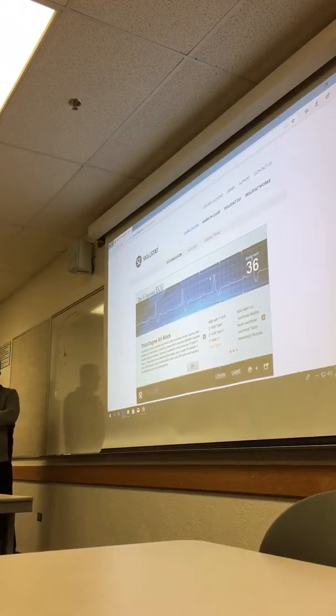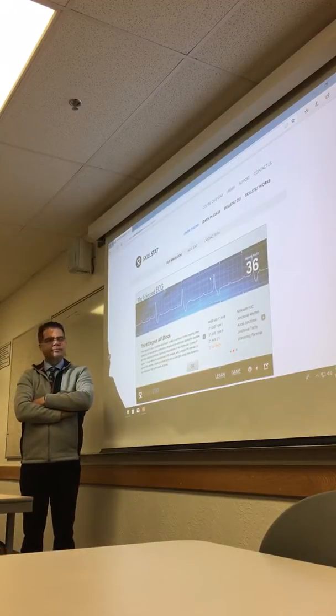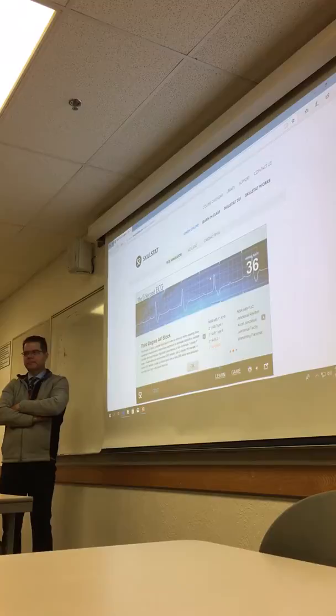So to answer my question from the beginning, P waves represent the atrial rate, QRS represents ventricular rate. Correct. Yeah, so P waves, what is a P wave? It's atrial contraction. What's QRS? Ventricular contraction, yeah.